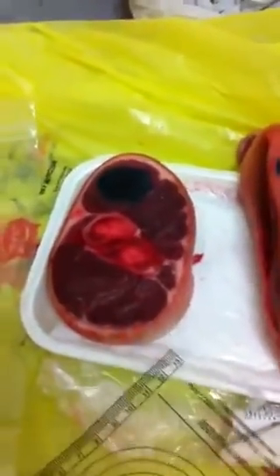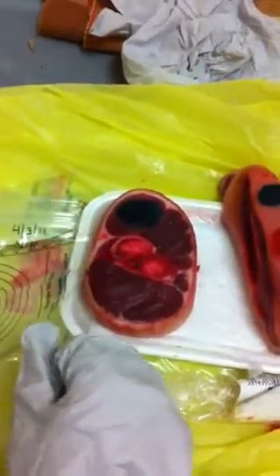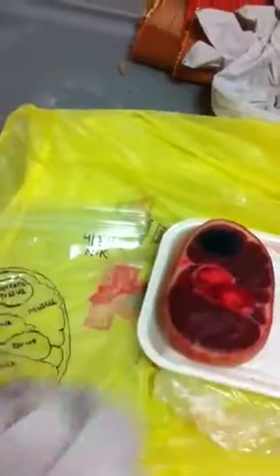What we are going to do first is measure the necrotic tissue using the scale we have over here. We are going to measure the necrotic tissue traced on the baggie. What we have here is 2 centimeters in length and 3 centimeters in breadth, so that is 2 multiplied by 3, which is 6 centimeters squared — the surface area of the necrotic tissue through the baggie.